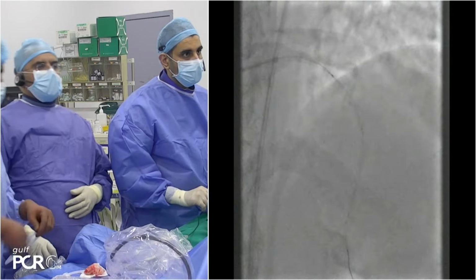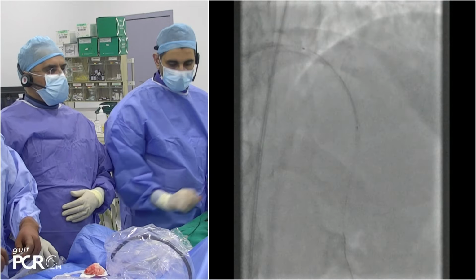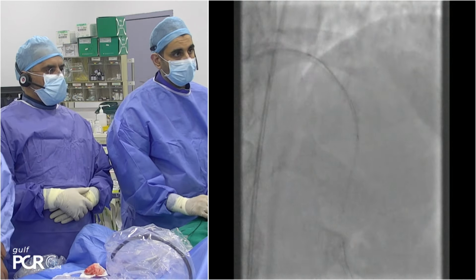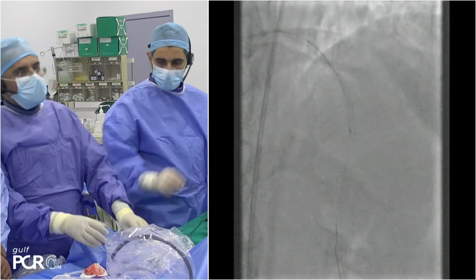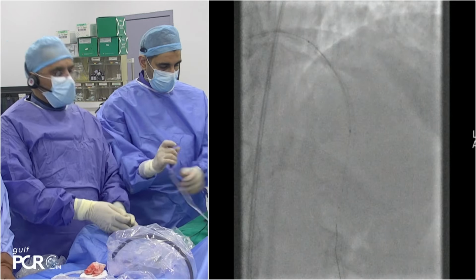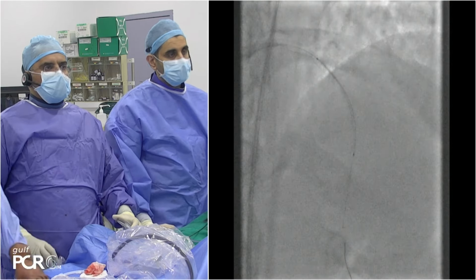With the idea of landing zone, there was no landing zone to start with, and there is no landing zone now. So exactly, we got away with this. So I wouldn't push it much harder. It's a good comment, and that's the consequence of that.